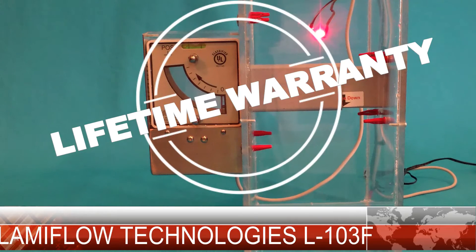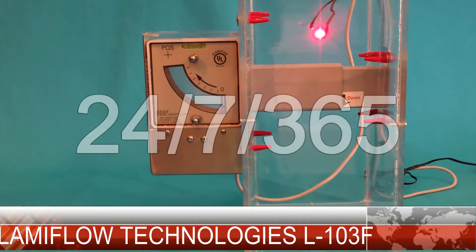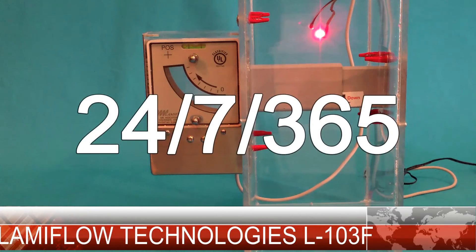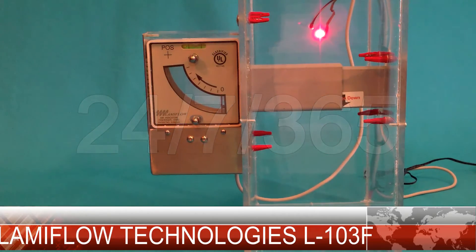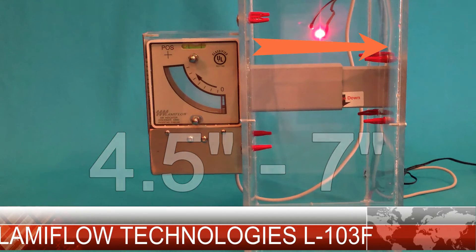We have a near zero percent failure rate with our rock solid design. The 103 series is engineered to run 24/7, 365 days to provide constant real-time airflow measurement. Out of the box, the 103 will fit a four and a half to seven inch width wall. Custom lengths can be ordered for any wall dimension.